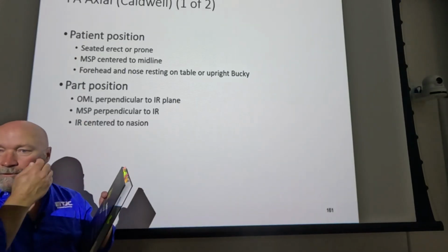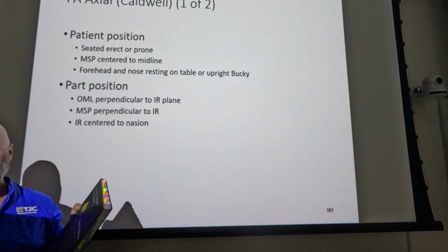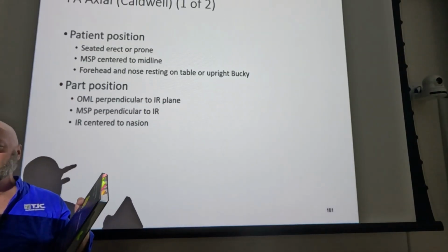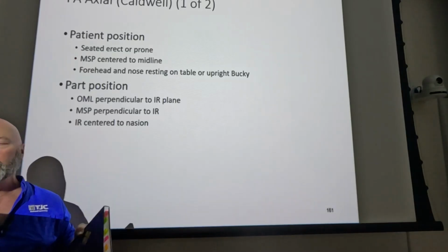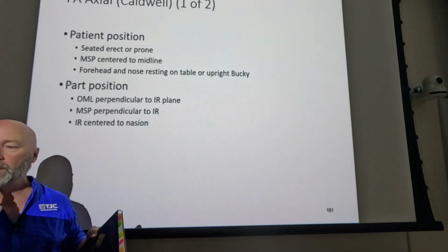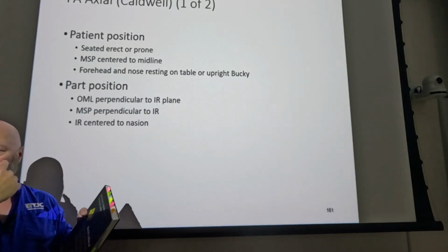Now I keep saying chin, cheek, and nose because, UT North, anybody? I think UT North still uses this, and that might be the only place it does. Okay, and what you're going to have a tendency to do is a year after graduation, you're going to forget chin, cheek, and nose, and you're going to go forehead, cheek, and nose.